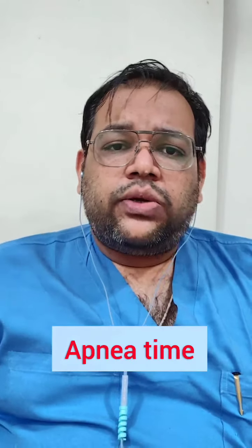Now an important thing to know is apnea time. When you put a patient on pressure support, you also have to see what the apnea time is. Apnea time is a protective mechanism for the patient. Apnea time means when the patient does not take a breath continuously for a certain duration of seconds, the ventilator will stop giving pressure support breaths and will change into control mode. That setting may be either pressure or volume control, depending on your ventilator. But apnea time can be increased or reduced based on your requirement.